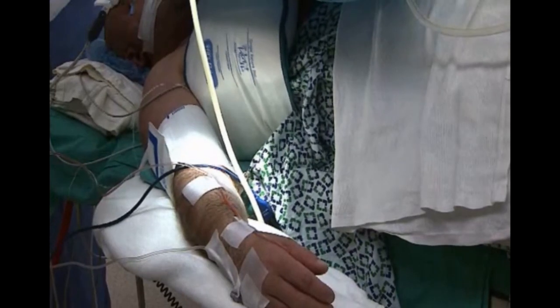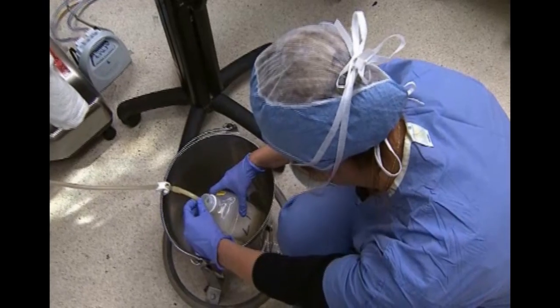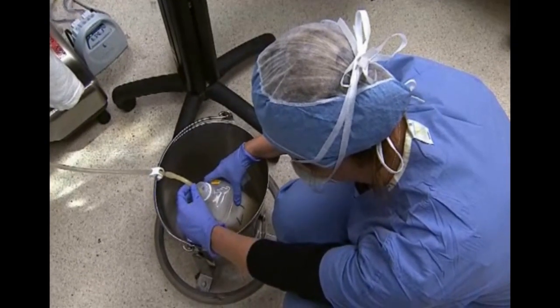After we fill that one lung, we drain it on the other side by gravity. As you see here, we're using a chest percussion machine to mix the lavage fluid with the proteins and help bring them out. You can see the tubing for that machine.